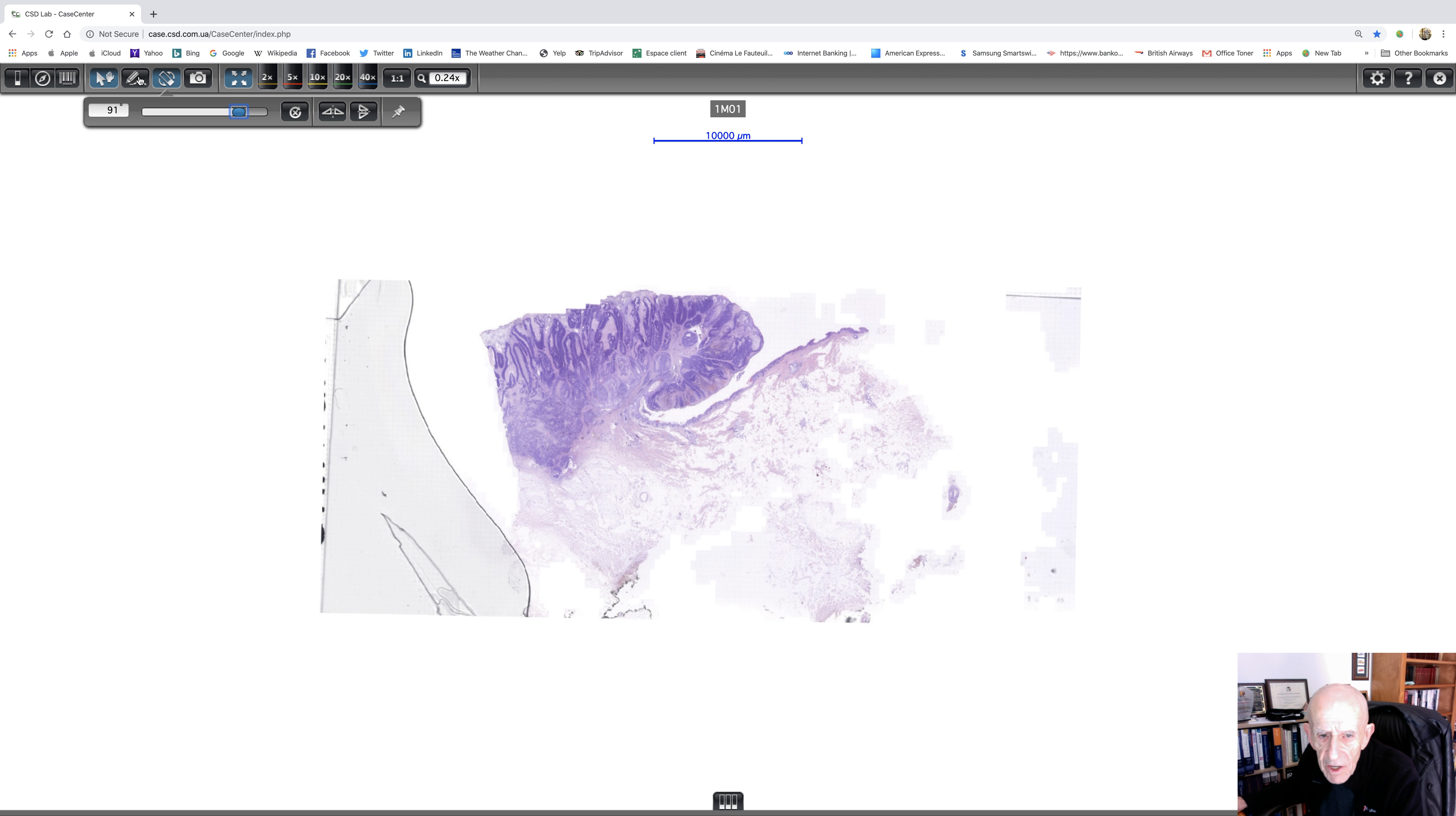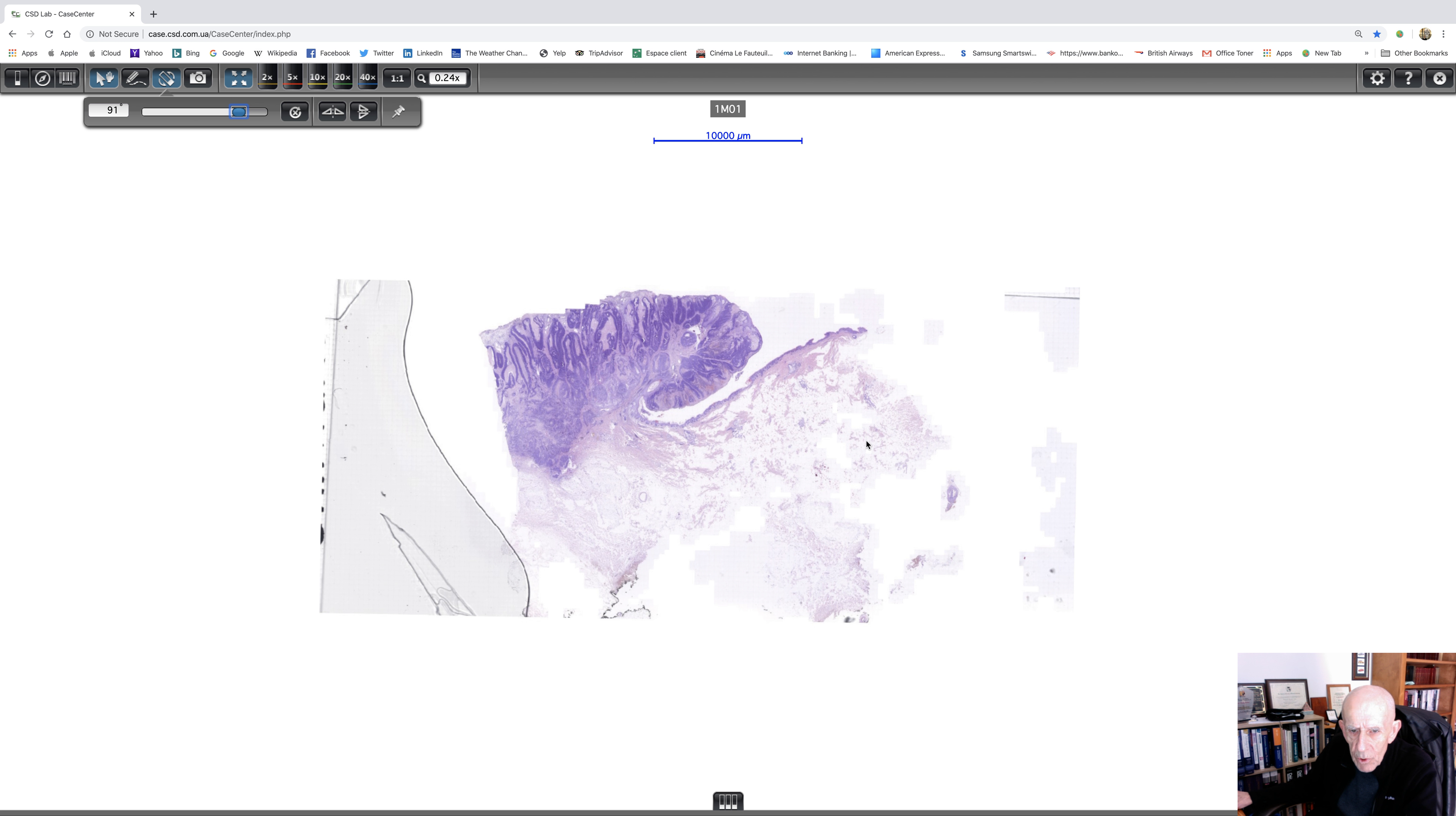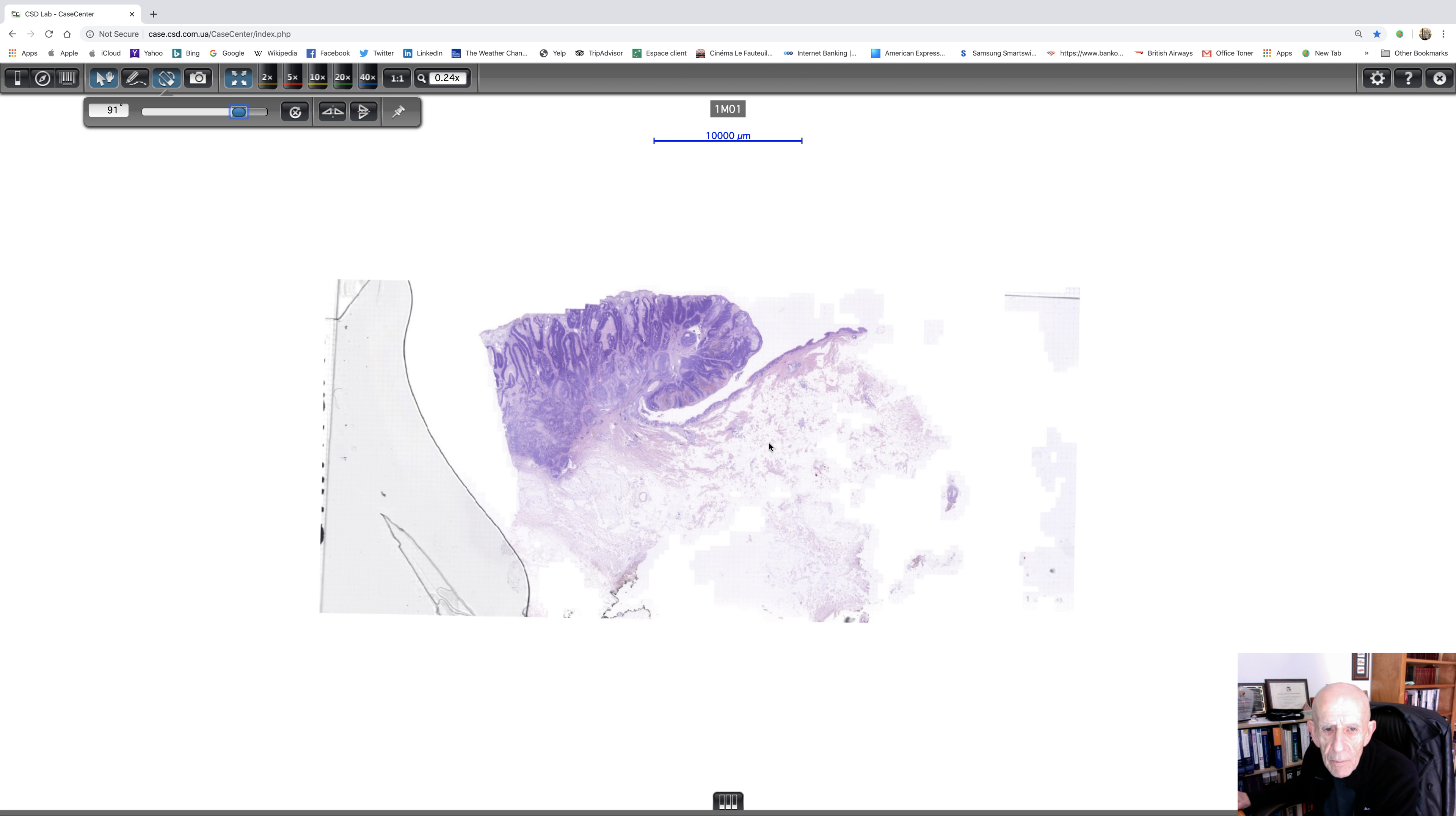I don't have any history, but we can see that the epidermis is rather thin. There's not much in the way of dermis, and there's a lot of subcutaneous fat. So the thinner dermis makes the back unlikely. The absence of hair follicles makes the head and the face and the axilla most unlikely. I would guess this may have come from the abdomen or perhaps it's come from a limb, let's say the forearm.